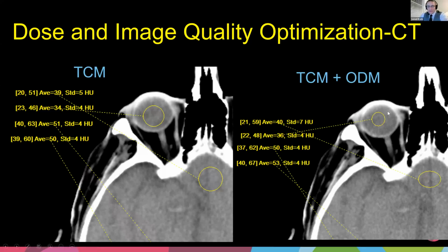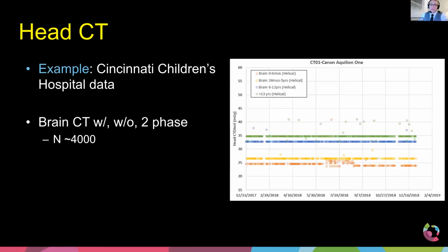Visually, you could probably say it's just a little bit, but in our practice of using this, the radiologists have never complained, and they've never said anything negative about it. So I think the change depends on maybe your sensitivity as a radiologist. It's hard to say that you'd really see a difference, but you may. All right, so those are a couple of the different ways to apply dose optimization when we're talking about imaging in the brain.